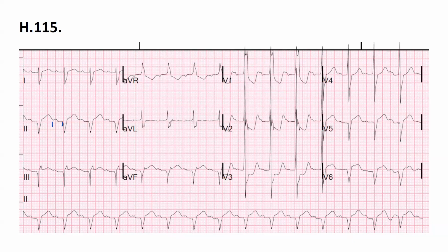All right. So look, when we are evaluating the P wave, what can we say about this P wave? First of all, the duration. And you are seeing that in lead II and aVR, right? This is direction. That's sinus or not. This is what you can say.